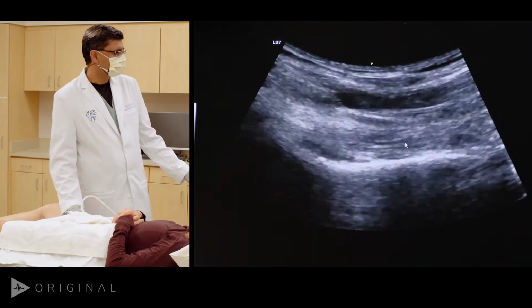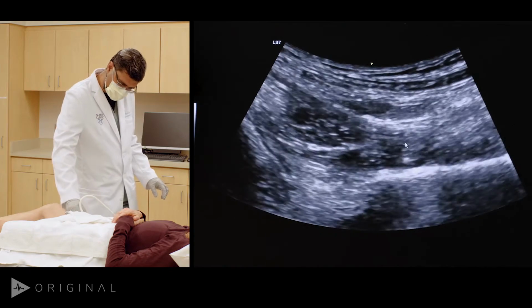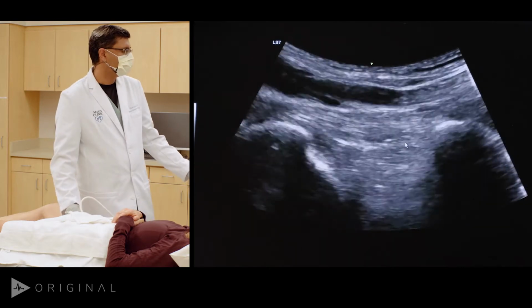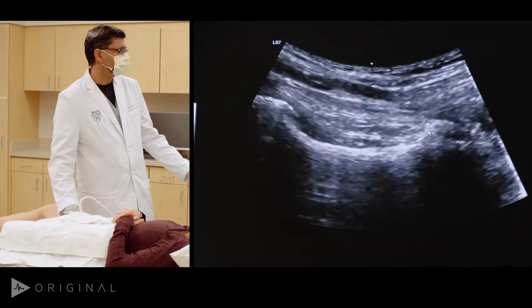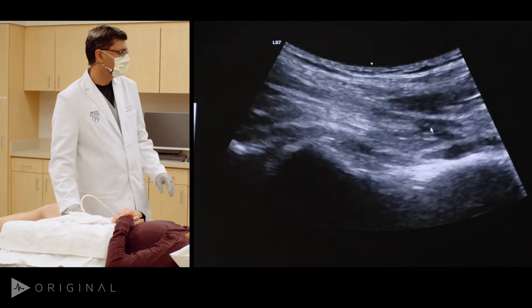So sometimes you have to turn your transducer, as I'm doing here. You can see how my transducer's lower part gets angulated so that I can hit the tendon at 90 degrees. So when I do that, now you can see how the echogenic psoas tendon is seen inserting onto the lesser trochanter over there. So that's a beautiful view of the psoas tendon distally.